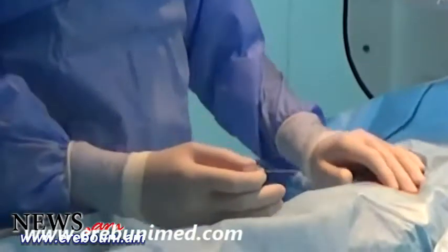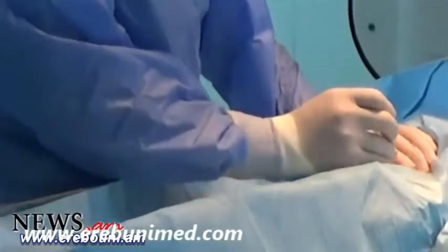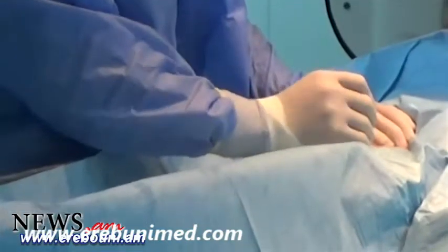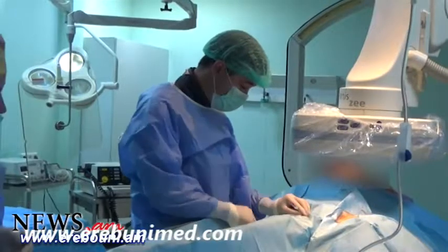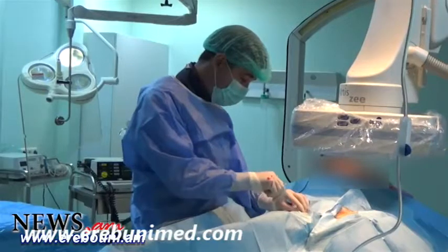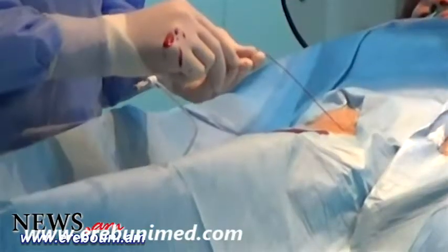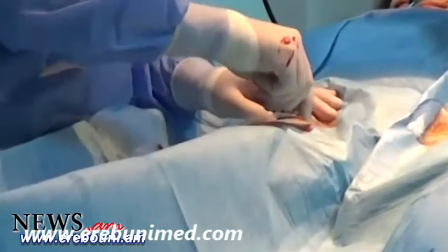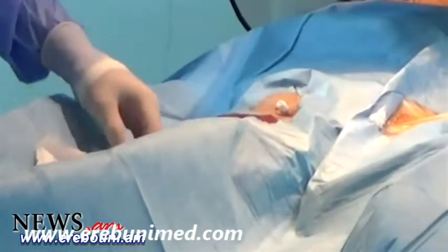We do a puncture of the femoral artery, after which we insert the catheter and enter into the arterial system. The essence of the intervention is that the blood supply of fibroids is ceased and they decrease in volume over months and turn into connective tissue, like grapes drying out and turning into raisins.